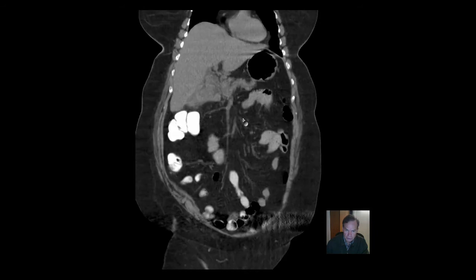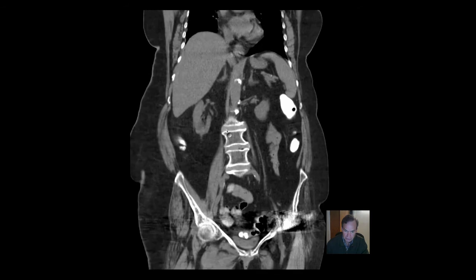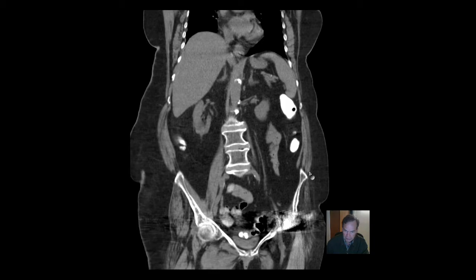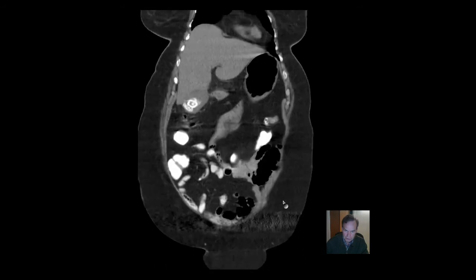So this is a coronal CT of the abdomen. We usually say it's abdomen and pelvis. I don't really view the two as discrete, separate compartments, but anatomically they are distinguished. And certainly in terms of reimbursement, it's a big component of deciding how much is going to be paid — whether you do just the abdomen, which is from the diaphragms down to the iliac crest, or whether you include the pelvis.